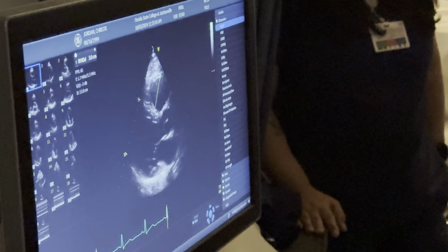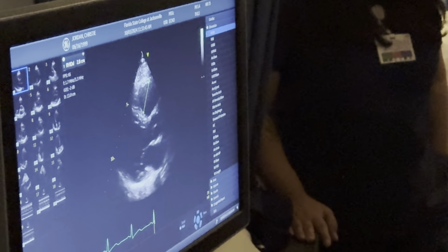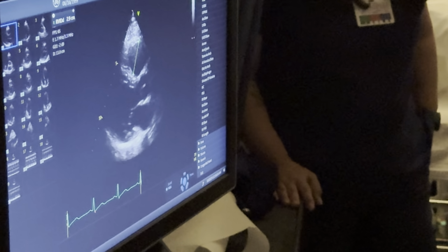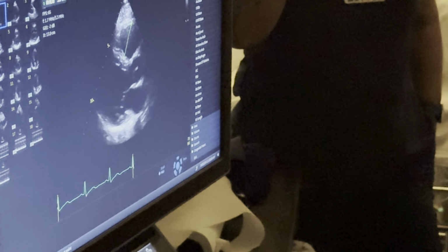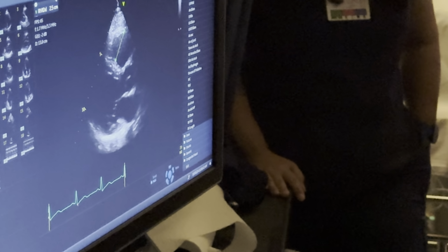Now we have to be careful. This is trabeculation from the right ventricle. So if I were to start up here, I'm going to make her appear to be thickened. And so I think this is the measurement where I'm going to measure here, because again, this is trabeculation.